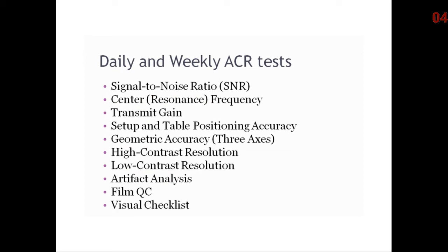Transmit gain, setup, table positioning accuracy, geometric accuracy, high and low contrast resolution, artifact analysis, film QC, and a visual checklist should all be done on a weekly basis, although artifact analysis and the visual checklist are things you should always be looking for every day during MRI.